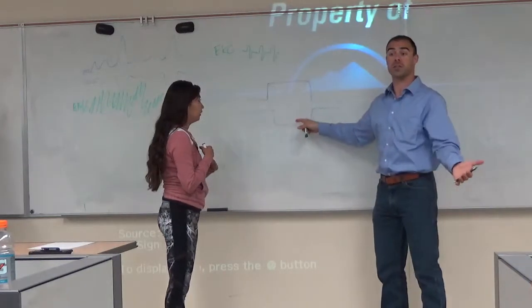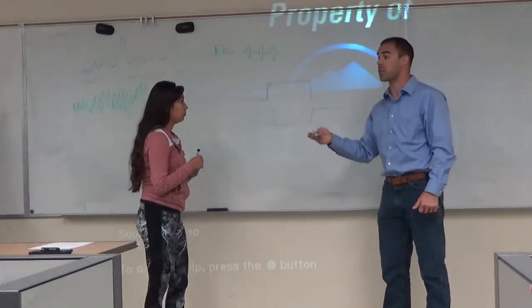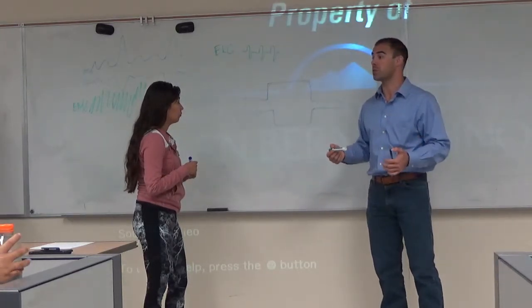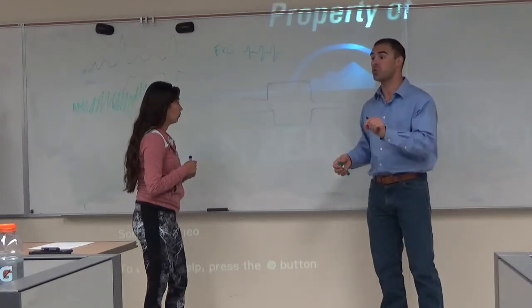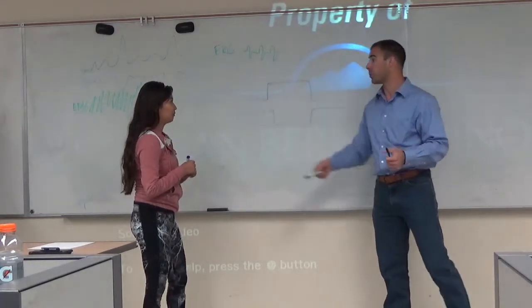Maybe this is brain activity. It'd be pretty weird brain activity, wouldn't it? One of the ways I'm trying to get us to think about this is that when we look at these electrical traces, we can use a lot of clues to figure out what it means. One of the big clues is which site on the head it was recorded from. That is, location. That gives us a lot of insight. So, what are the locations that we should label this from?